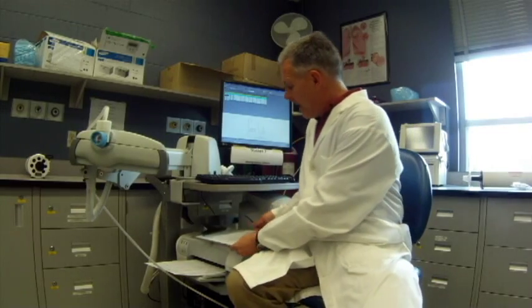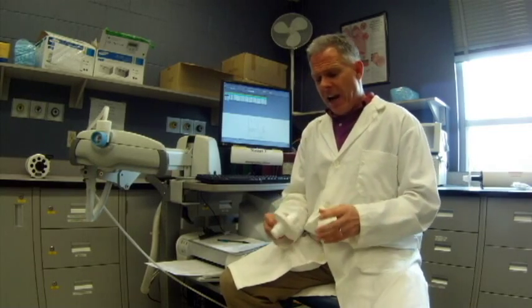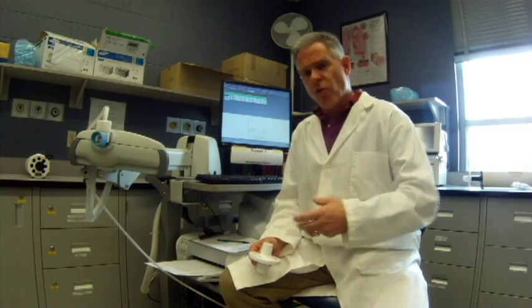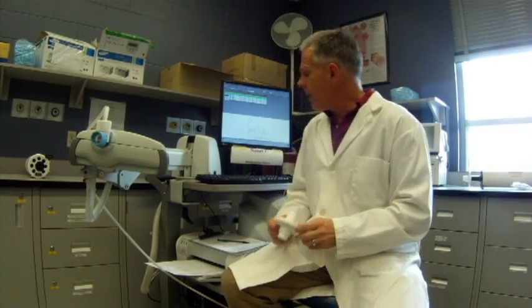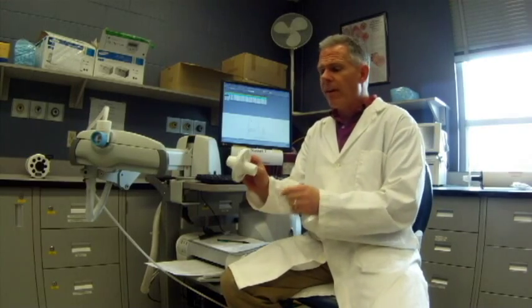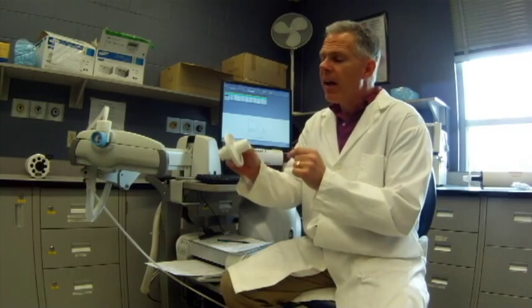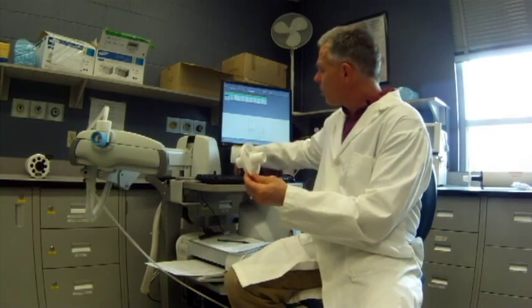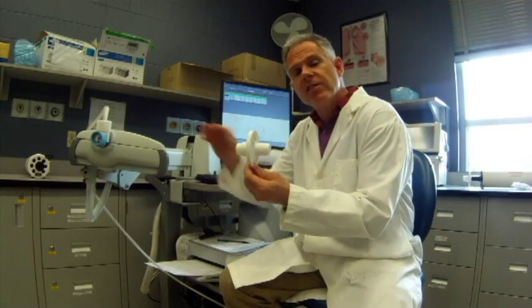One of the first tests we're going to do is a slow vital capacity, which is often the first test we recommend doing. Once the patient has a good history and understands why they're doing it, a key part of pulmonary function testing is coaching effectively to get good results. For the slow vital capacity, we want the patient to be aware they'll be using a filter. All the air has to go in and out through this filter, which is hooked up to a device that measures flow rates and volumes.